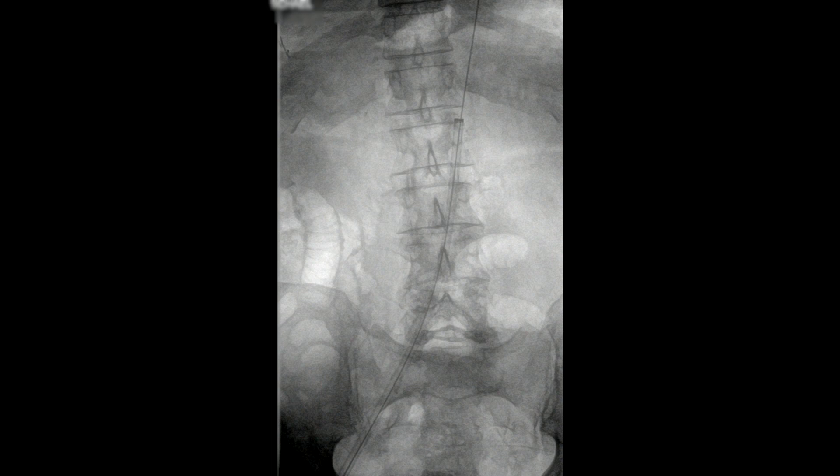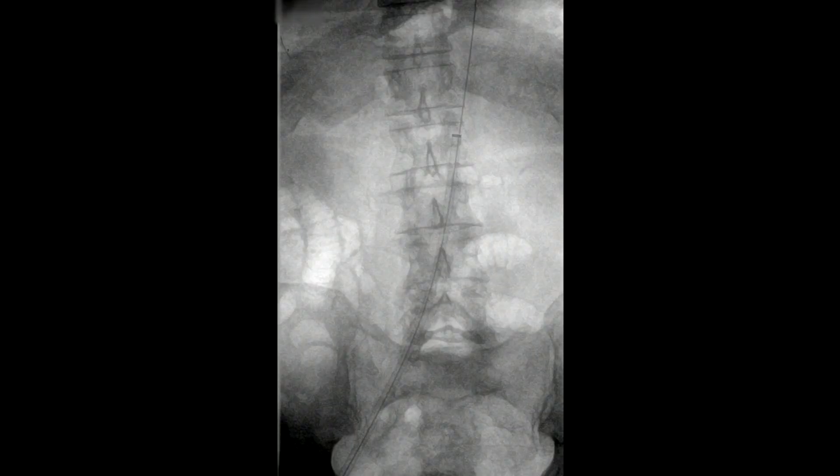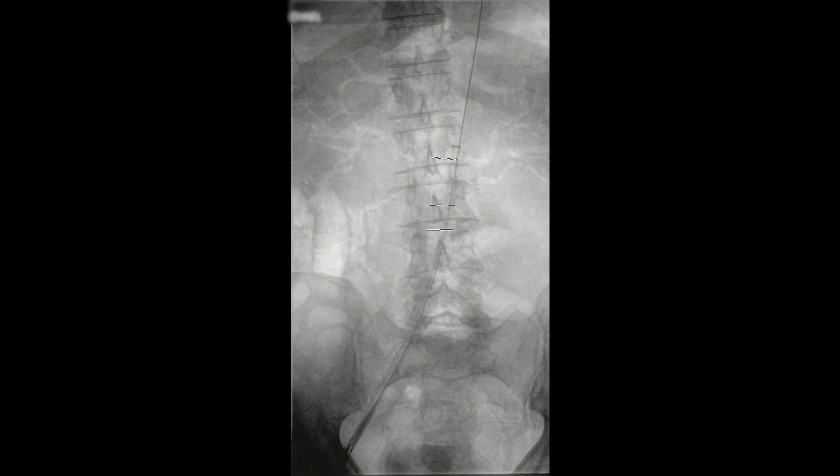We had previously measured this. The aorta measured about 16 millimeters in diameter and the length of that circular outpouching was approximately one and a half to two centimeters of the left side of the aortic wall. For this reason, we planned to cover this simply using a Gore extension cuff.